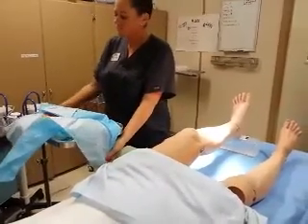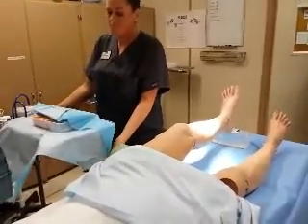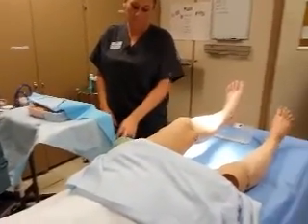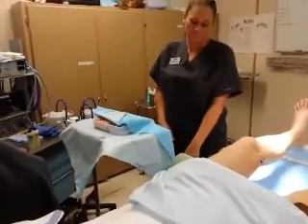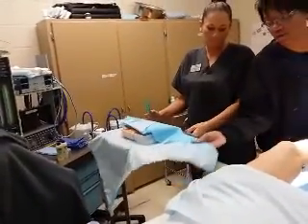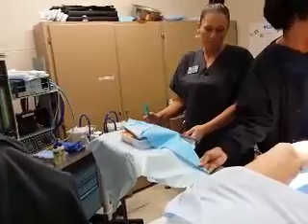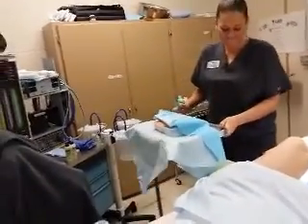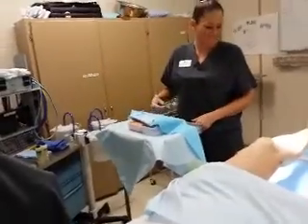I'm going to interject here while she's opening that. See how she moved her hand back? If your wrapper hits the bed, you've contaminated. And I didn't mention that. When you open, make sure that doesn't go across the bed. This should not be at any point over there or over here like that. Okay. Oh, did I hit you? It's okay.